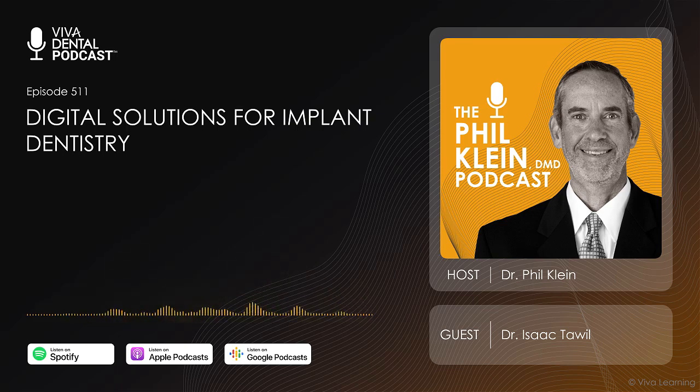When it comes to full arch scanning, more recently, some newer scan bodies have come out that allowed us to really perform even full arch dentistry with full arch scanning.